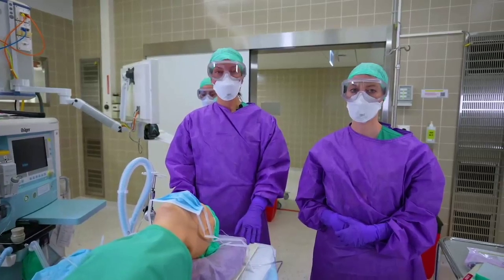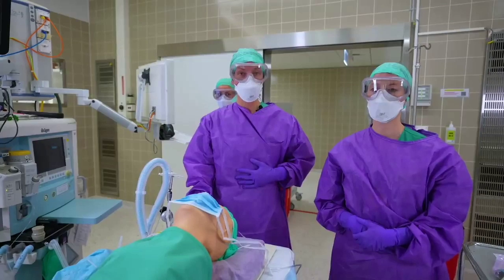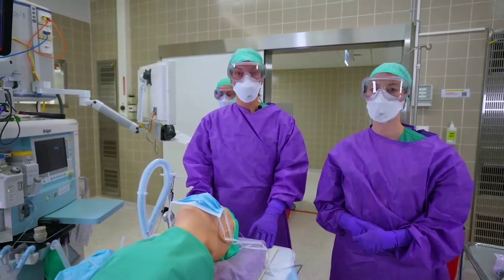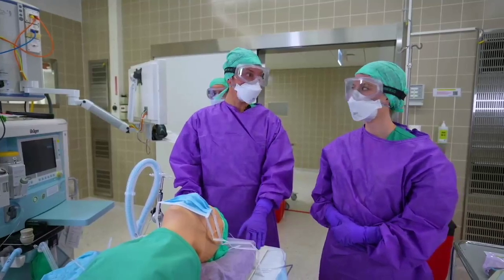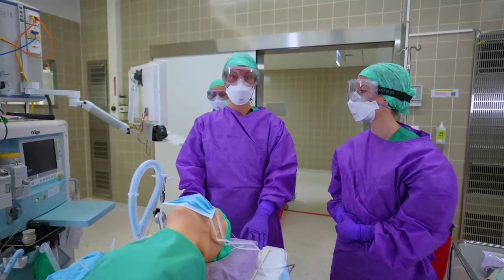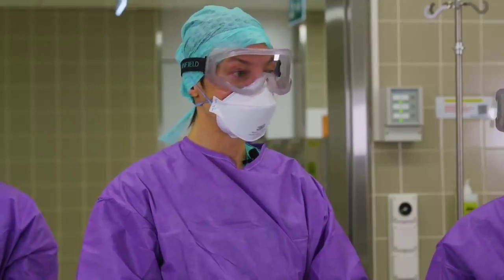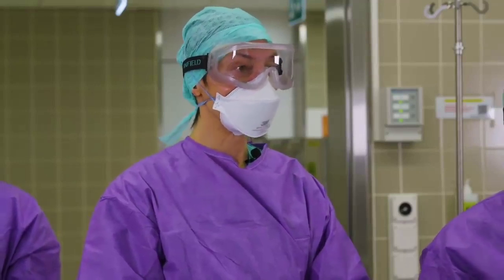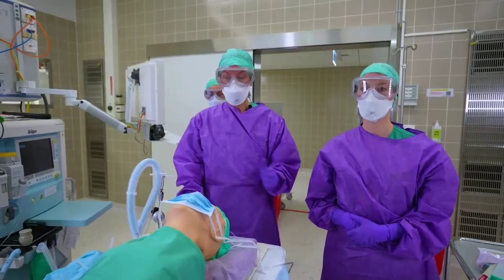After successful extubation, it's important to doff your personal protective equipment according to your local standard operational procedures. Again, a body check is important. We also recommend debriefings after intubation and extubation to further optimize your procedure.